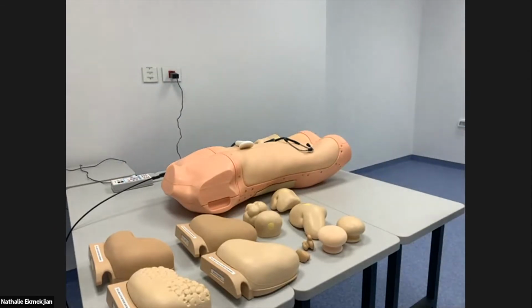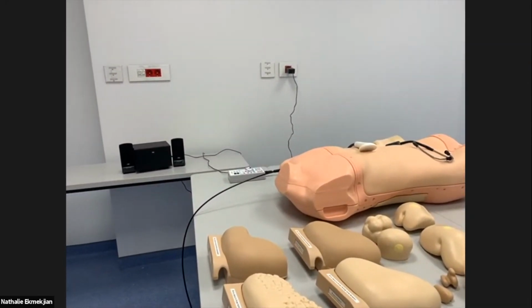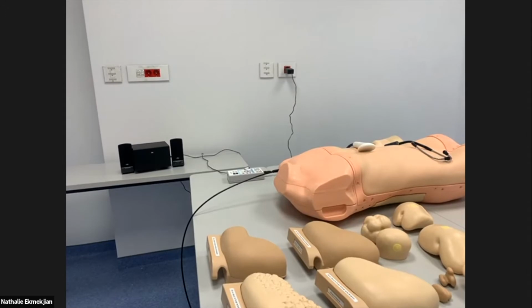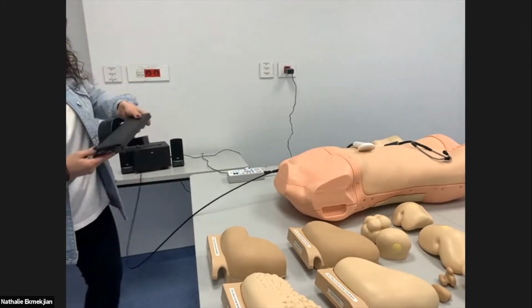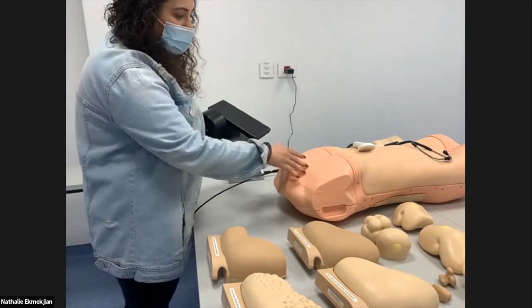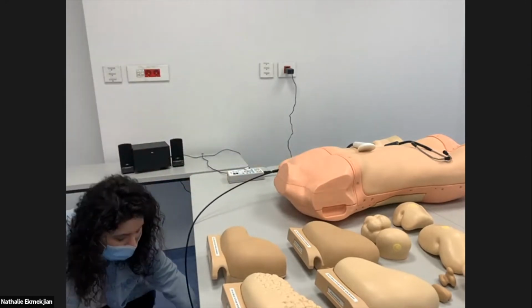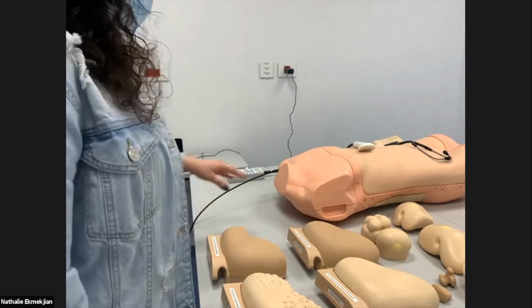If you can see here, I'm just going to show you the speakers. So here we have the speaker. This doesn't come with the set, but you can use any speaker for classroom training, so that when we have 30 attendees, they can hear the auscultation for group learning. And here for the respiratory motion unit, this is the foot paddle. Once we put the liver inside the body, this is the foot paddle that can be used in order to simulate inspiration and expiration for the liver motion.